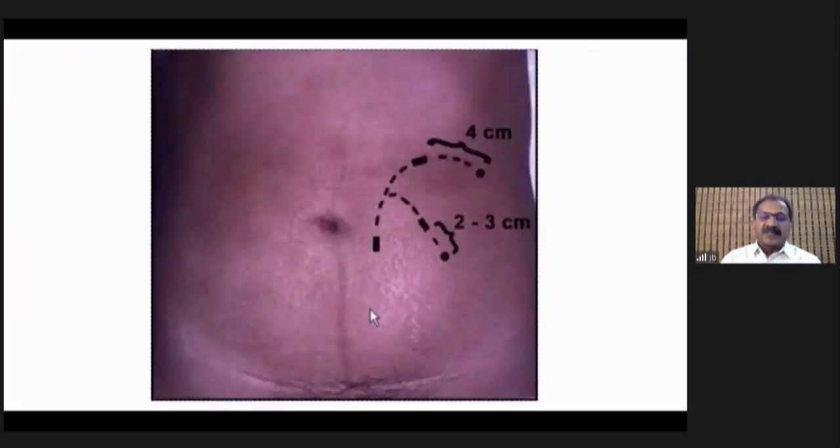And this picture shows how routinely, if this is the inner cuff, you bring it out and have the outer cuff, and if you want the exit site to be higher, then the curve has to be slightly different. But in a COVID situation where you feel that the patient might require prone position ventilation in the future, you can bring out the catheter much more laterally.